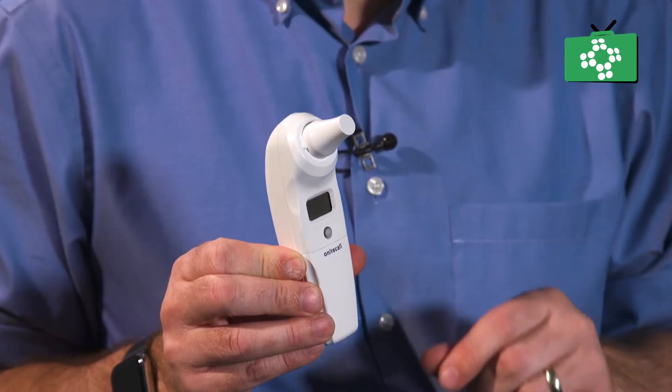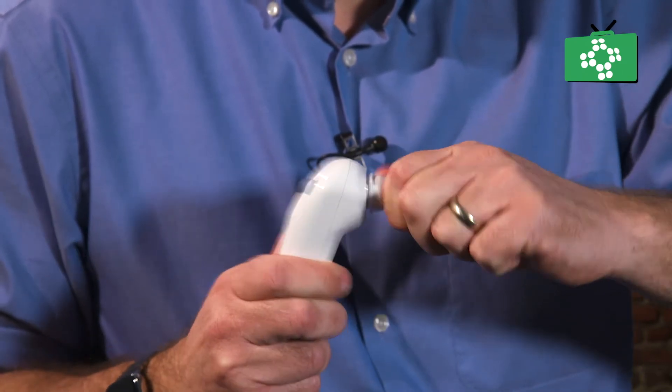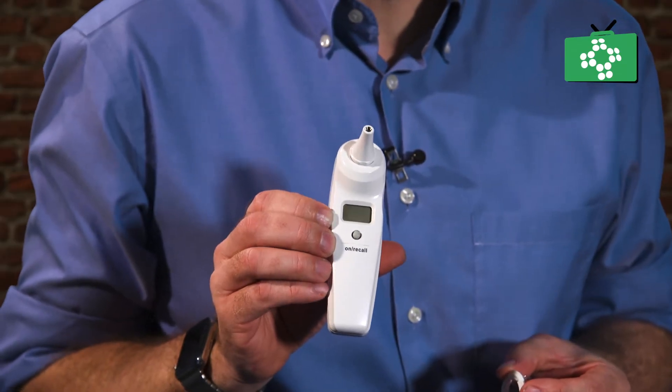The ear thermometer is slightly different. With this, you have a cap on the top which you just twist and the cap comes off. On the front you have a button that will turn the unit on, and most of these also have a memory function, and a scan button on the end.